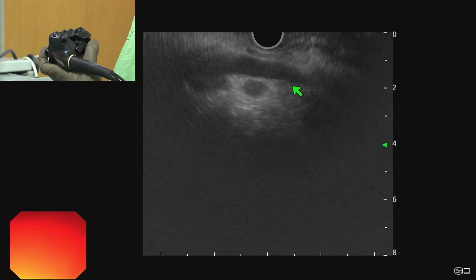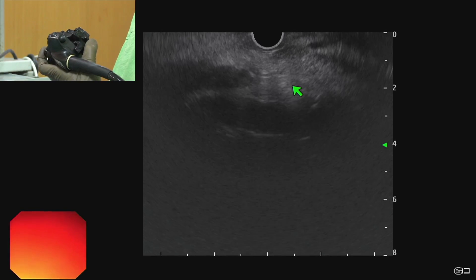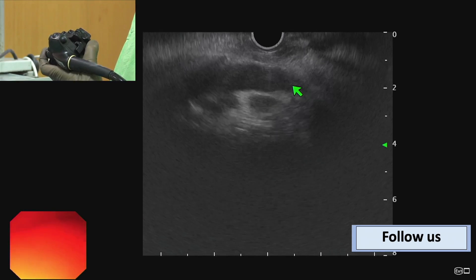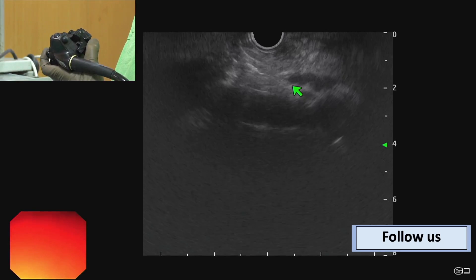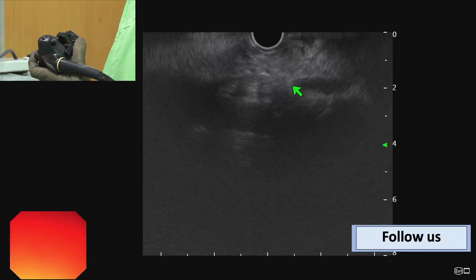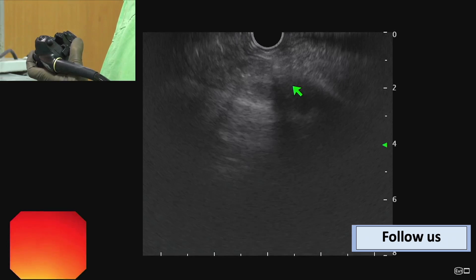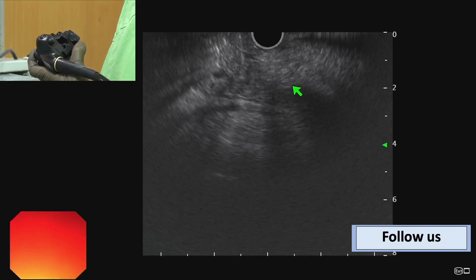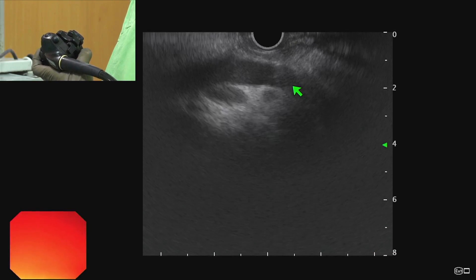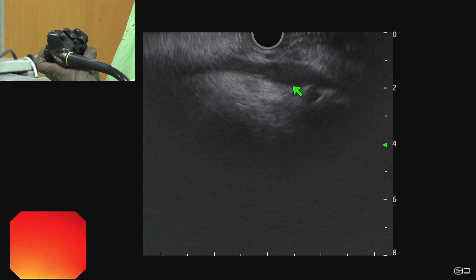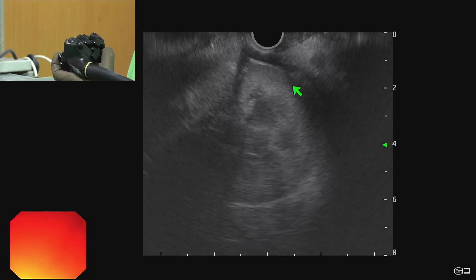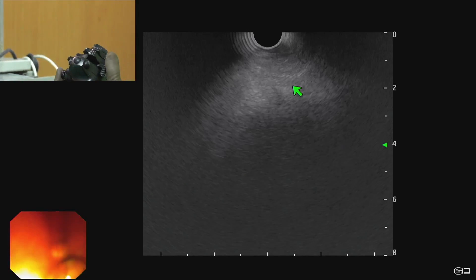Here we can see the upper structure is the IVC, and with the clockwise torque below the IVC we should be able to see the aorta. Between the IVC and the aorta there are multiple lymph nodes. These lymph nodes are paracaval, para-aortic, and aortocaval lymph nodes.